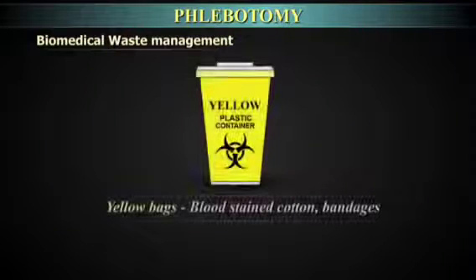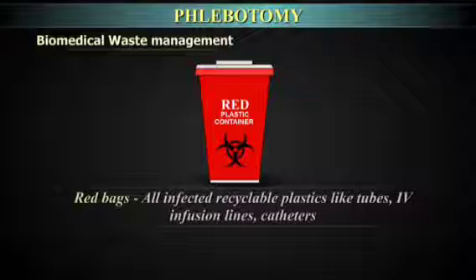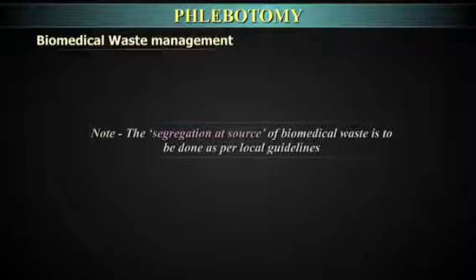All blood-stained cotton, bandages, etc. go into yellow bags. All infected recyclable plastics like tubes, gloves, IV infusion line, catheter, etc. go into red bags. The segregation at source of biomedical waste is to be done as per local guidelines.